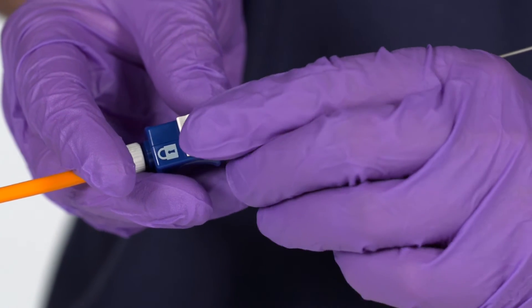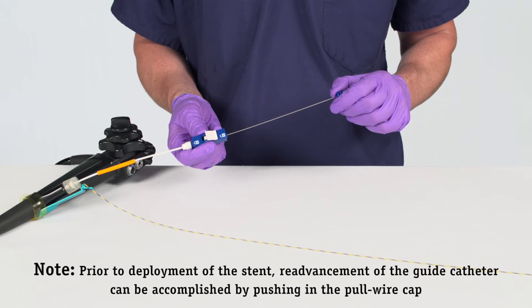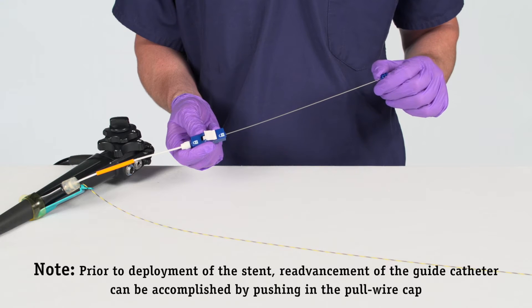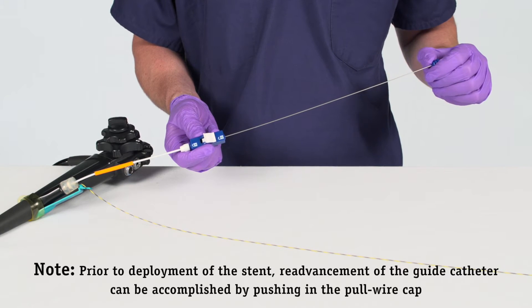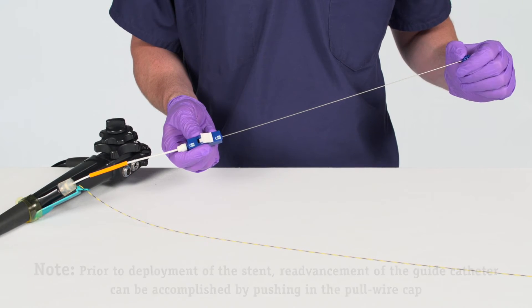Unlock the Naviflex RX Delivery System Locking Mechanism. Advance the stent into the desired location in the duct using the push catheter. Simultaneously, maintain the guide catheter RO marker position in the desired ductal location by retracting the guide catheter.